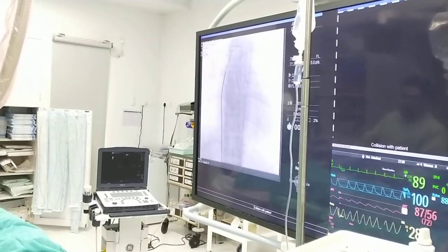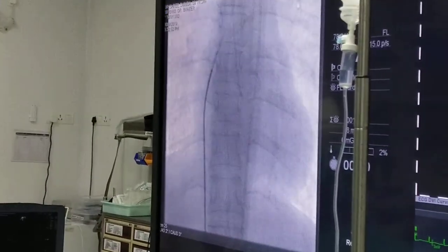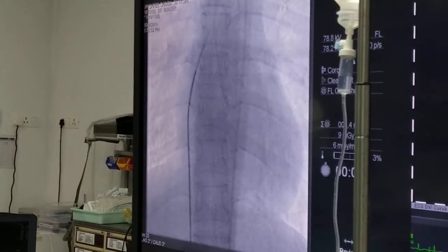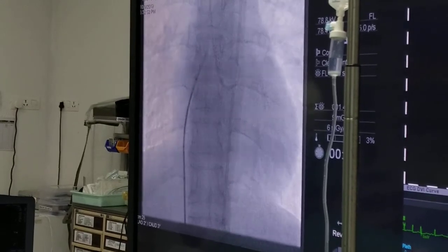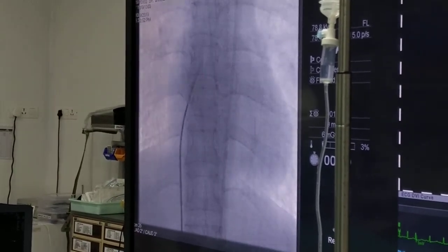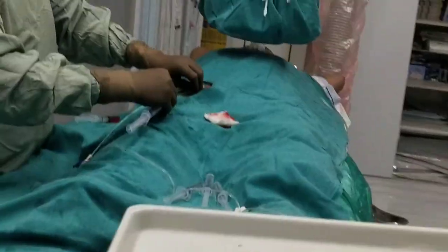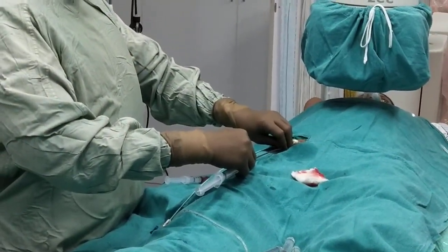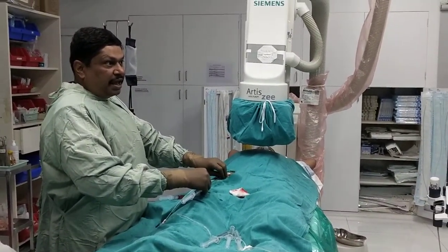We try to go into the anterior gutter of the right atrium and find the weakest part of the septum to puncture. While going down, we rotate it clockwise and go into maybe the four o'clock or five o'clock position so you face posteriorly — the hand goes posteriorly, pushing into a four o'clock or five o'clock position — and you will start feeling the atrial pulses there.